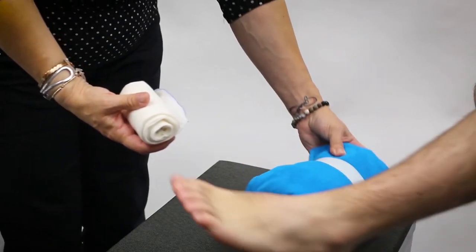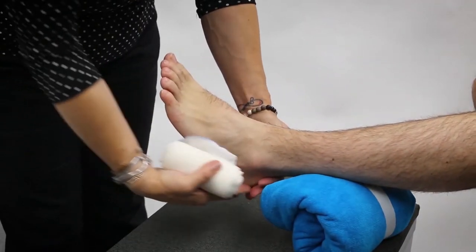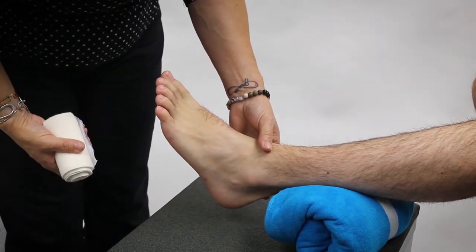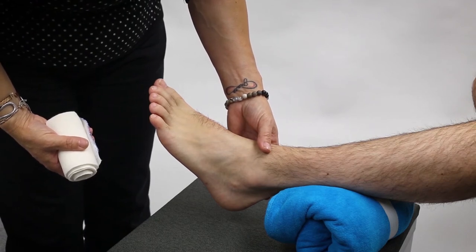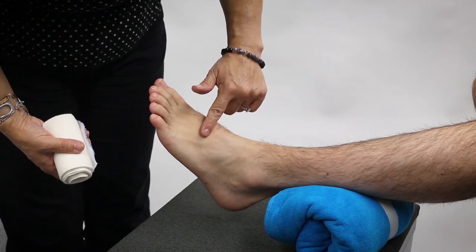Let's also review an ankle wrap, since this joint is a little more complicated than wrapping a knee or an elbow. You want to make sure that your wrap is ready and that you're using either a towel roll or blankets or something to support the leg in a comfortable position. At home I also like to use the end of the sofa, having the leg over the end so that the ankle is exposed and the area that you need to wrap is exposed.